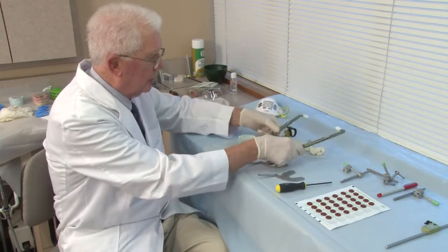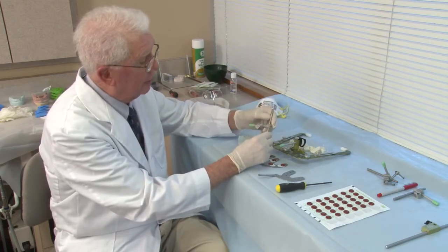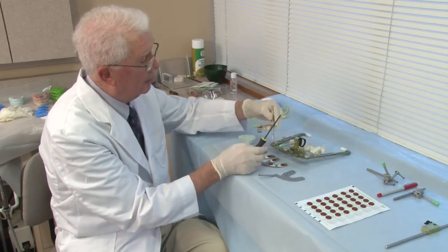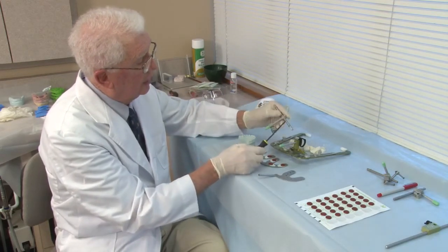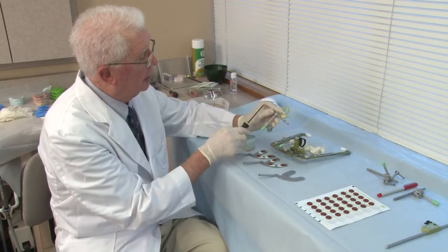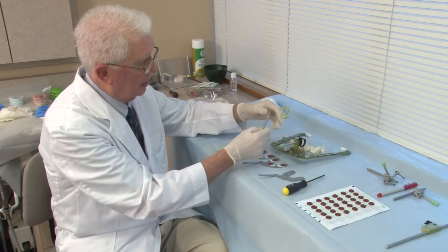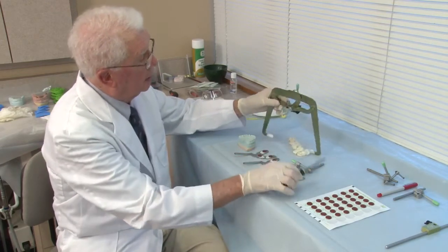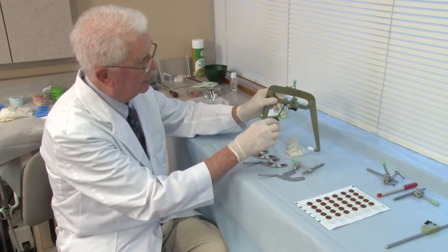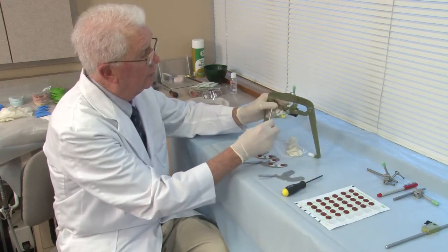Now, we also want to have our bite fork assembly ready to go. On the bite fork assembly, on the vertical post, there are two flat areas. One is longer than the other one. The one that is short goes onto the ear bow, and it fits into this hole here. So the vertical part of the bite fork assembly goes into that hole, with the flat side toward the screw assembly here.